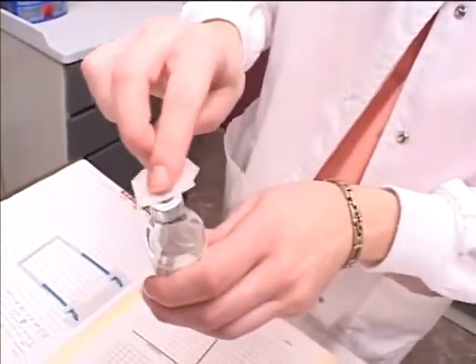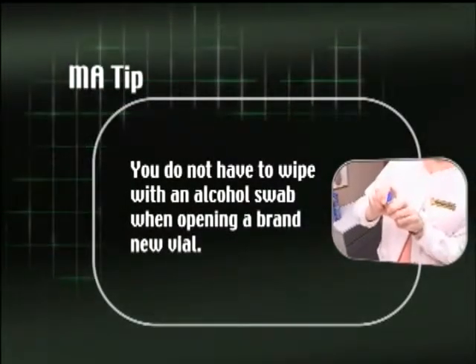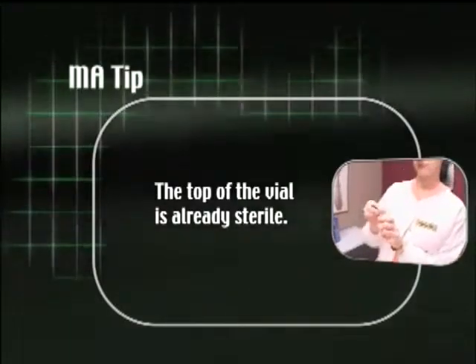Swab the top of each vial with alcohol. MA tip: you do not have to wipe with an alcohol swab when opening a brand new vial. The top of the vial is already sterile.